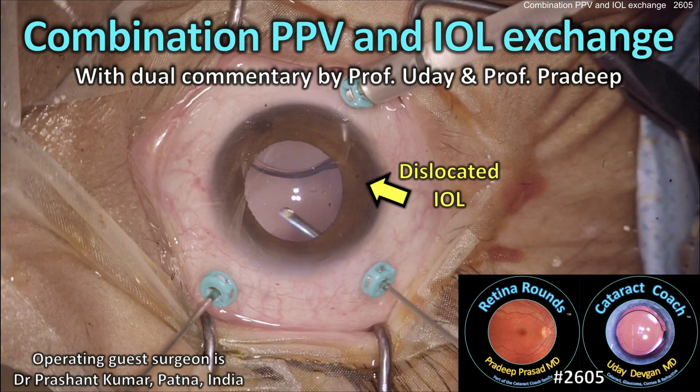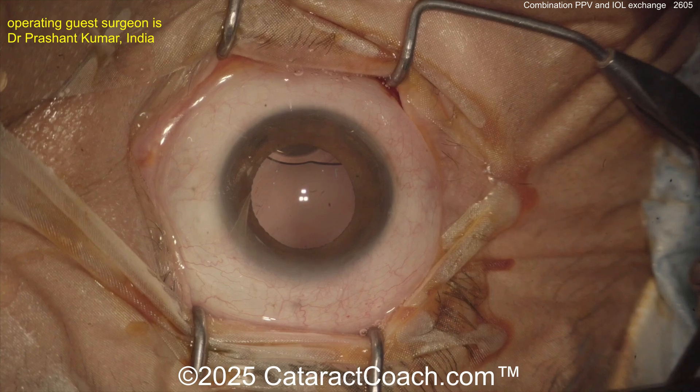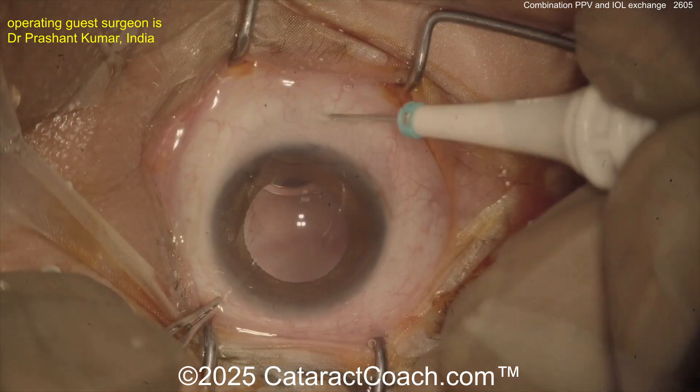CataractCoach.com — a combination pars plana vitrectomy and IOL exchange, but with the surprise of a hidden CTR. We're with Dr. Pradeep Prasad. Let's start this fun video.